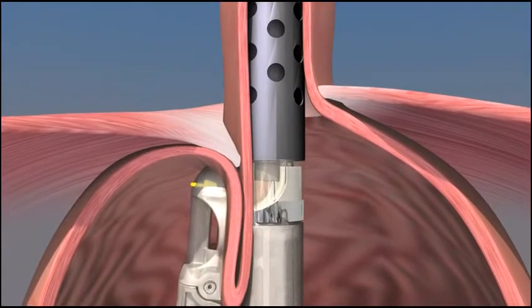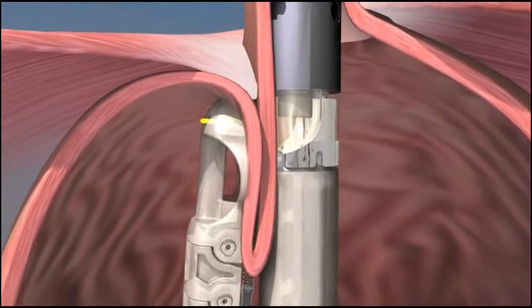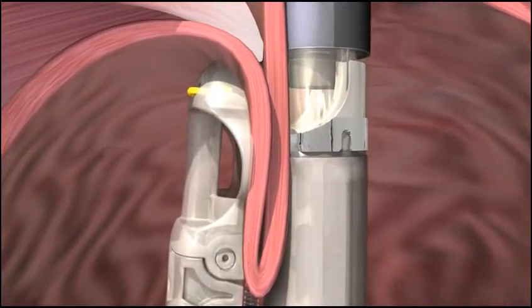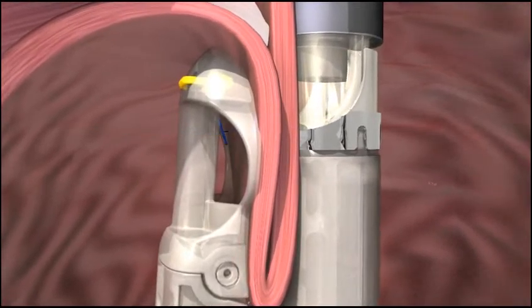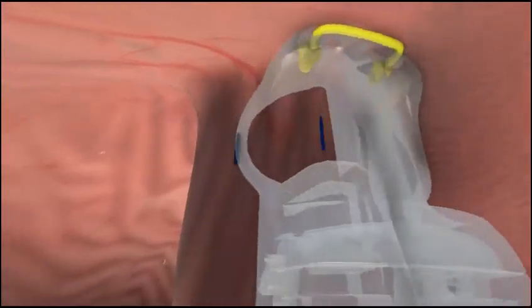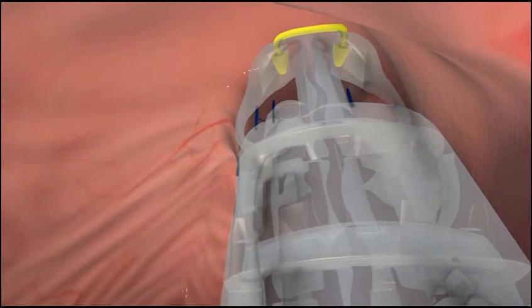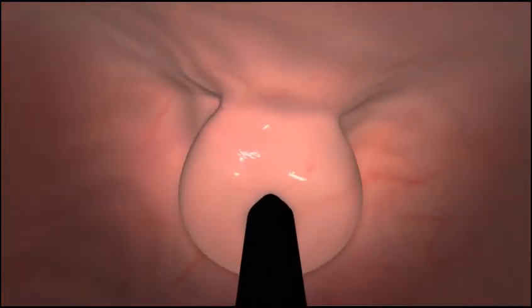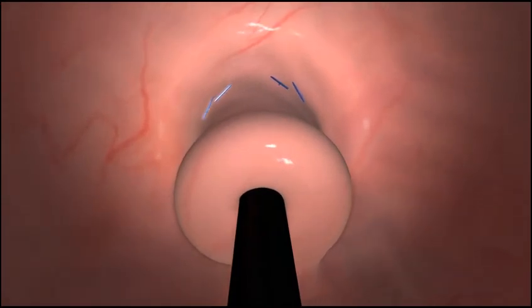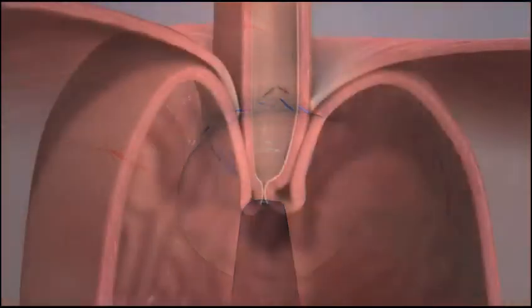The Esophyx device is then rotated, wrapping the fundus toward the lesser curvature of the stomach. Under visual control, the Esophyx device is then used to deploy two H-shaped fasteners to hold the fold of tissue in place and maintain the wrap. The wrap is then tightened further and the next pair of fasteners are placed one centimeter above the Z-line. This procedure is repeated on the opposing side. The valve is extended, creating a long three to five centimeter flap and securing it with H-shaped fasteners.